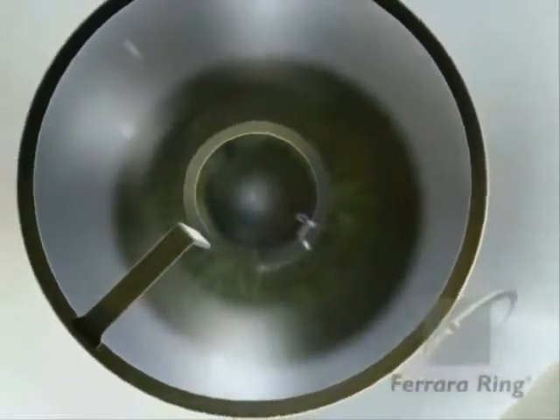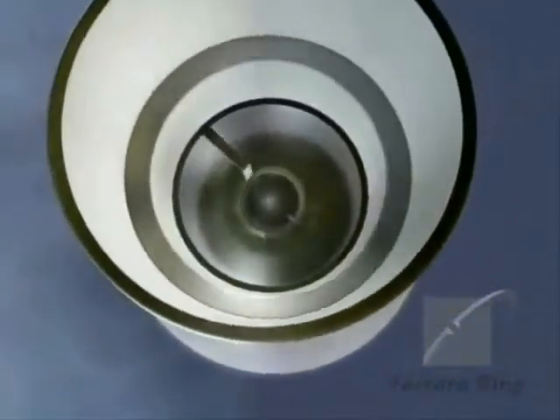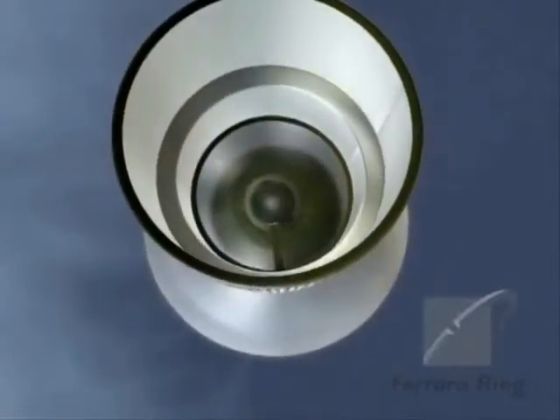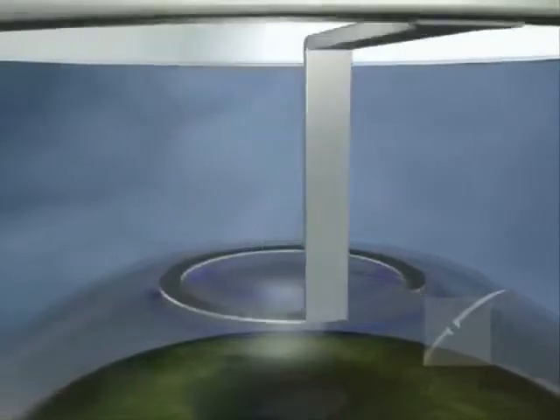Tunnel until the 180-degree mark and return. Utilize the same procedure with the other spatula to create the opposite tunnel. Do not permit the spatula to incline — maintain it flat. Do not force the spatula upward or downward.